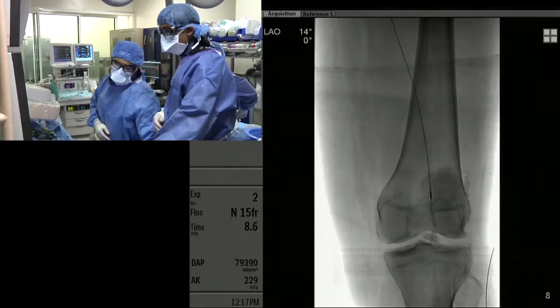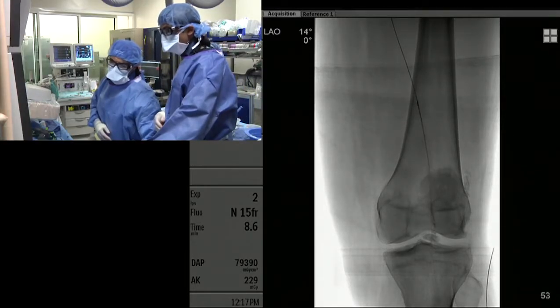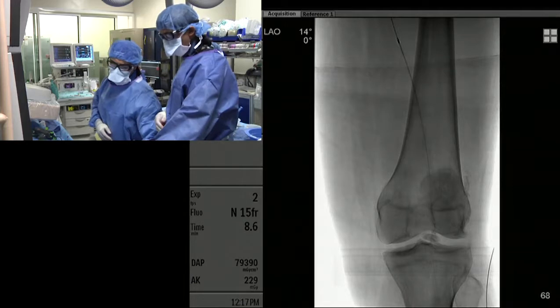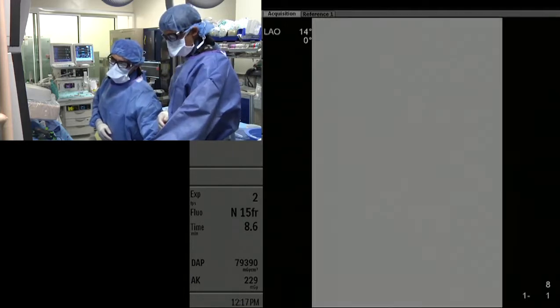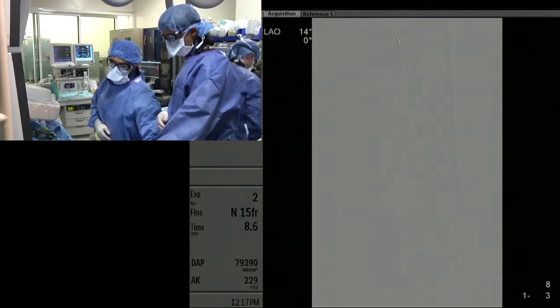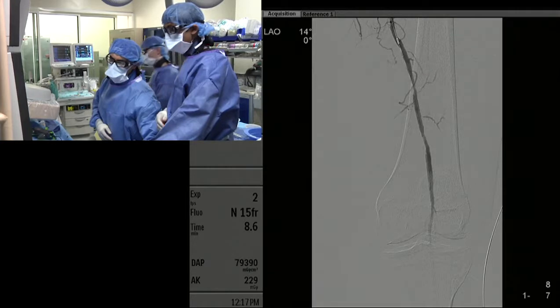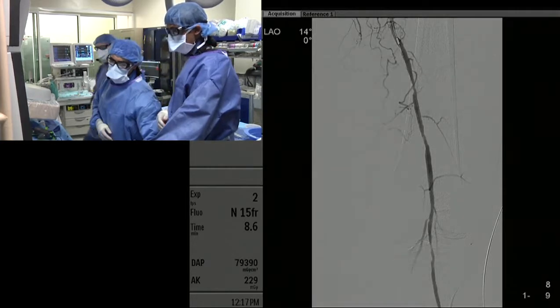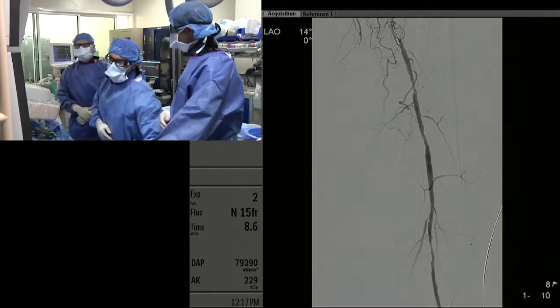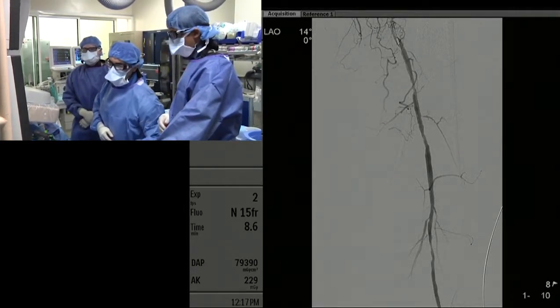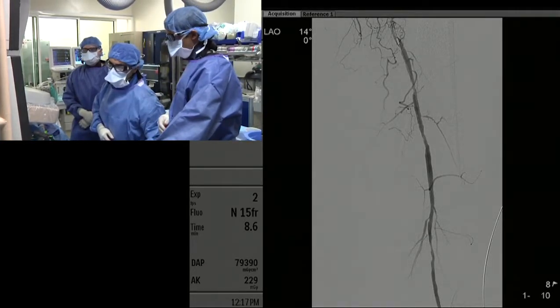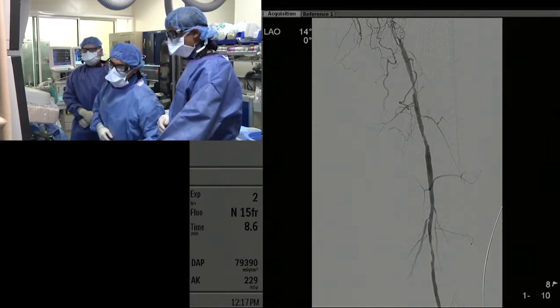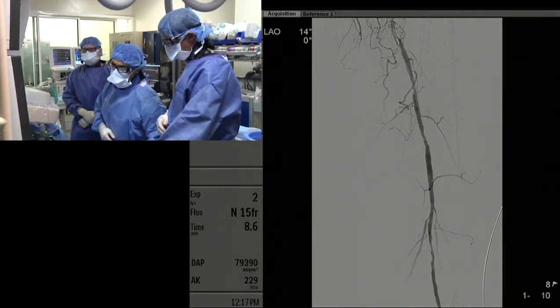This is an orbital atherectomy, and you want a smooth, consistent motion with the blade. We have 15 centimeters of throw, so I think we can treat this whole segment. Depending on how much disease there is and the tightness of the stenosis, you may need to go at a slower pace — it's basically like rubbing out pencil with a pencil eraser.